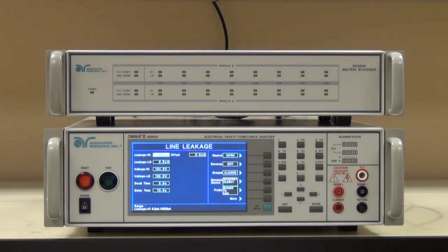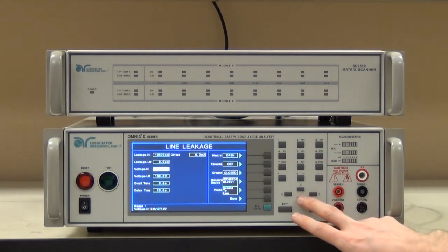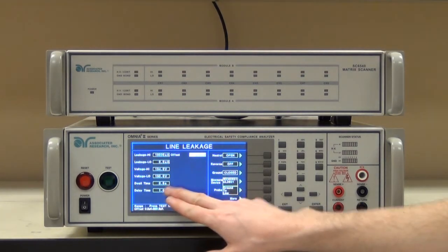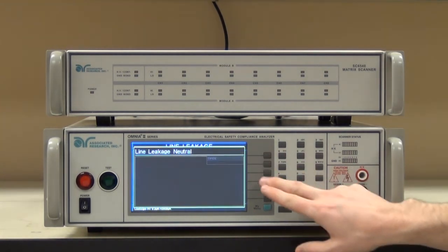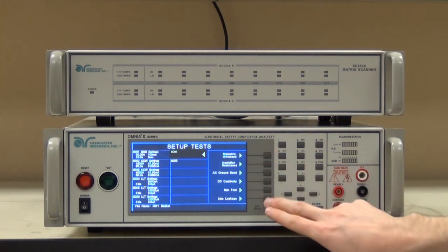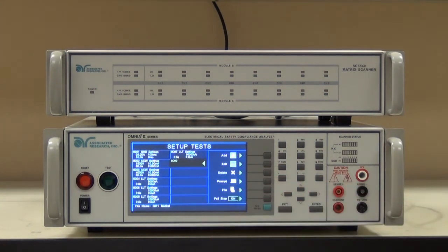Per the standard, once there's a single fault condition, the high limit actually increases to 10,000 microamps. Additionally, since I have continuous on, I don't need this 10 second boot-up time again — I simply need a little bit of time to allow the product to keep going, and then have it take a measurement with the dwell time. That's all I would need to do for this single fault condition, because all of my other parameters remain the same. We'll add one more with an open ground — closing the neutral once again and then opening the ground, keeping the same parameters. And then finally, I'll finish off with a closed ground but reverse polarity.